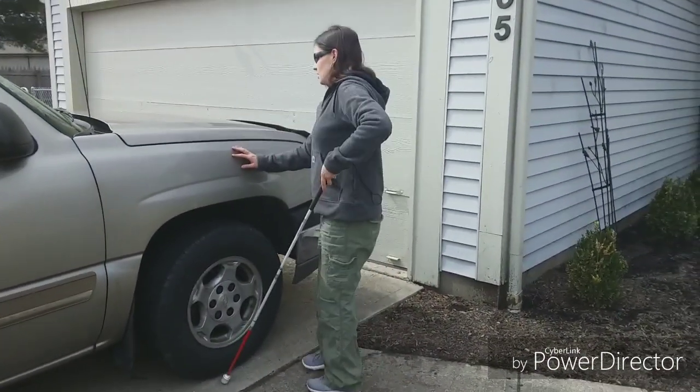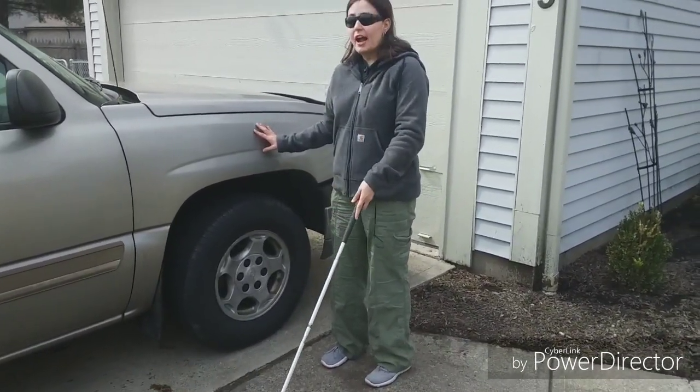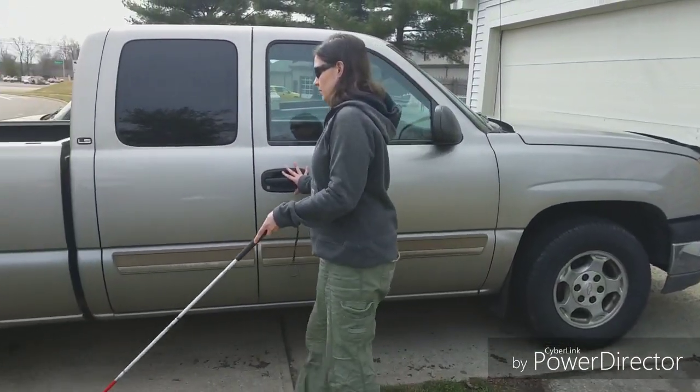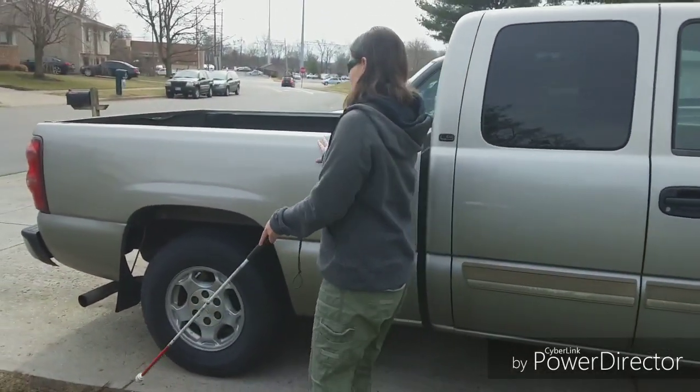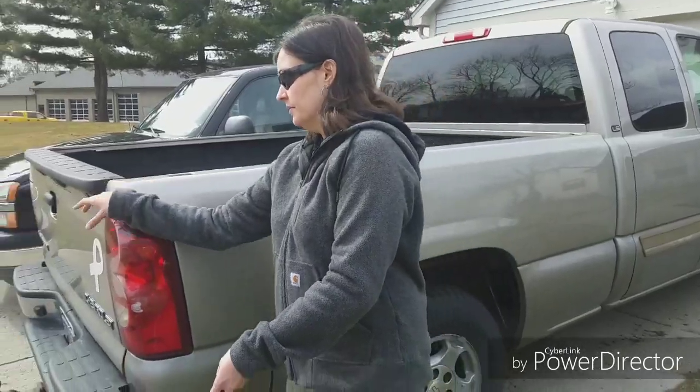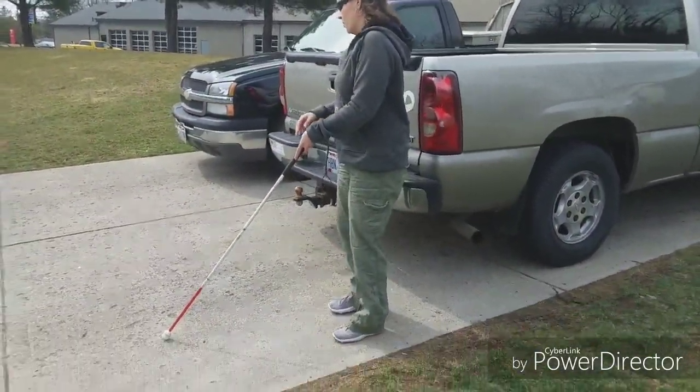So how would you go past the truck? You just touch it. I would put the cane in this hand. One thing I wanted to ask — because I know somebody may ask — how do you avoid the mirrors on a car? I avoid them because I know they're there. I know where they're located. I'm really observant of things I encounter every day, so I know the mirrors are by the front of the truck.